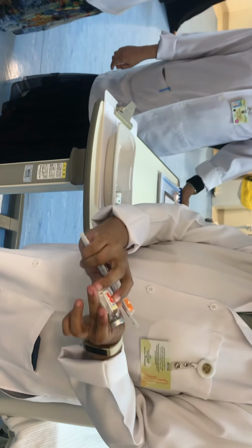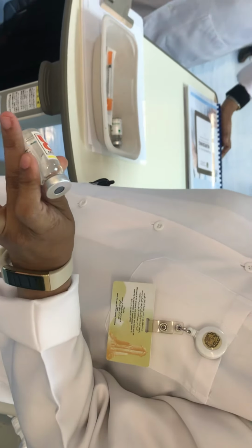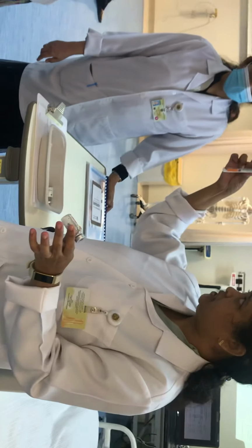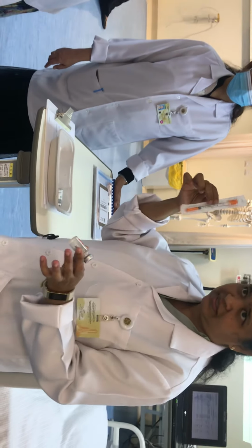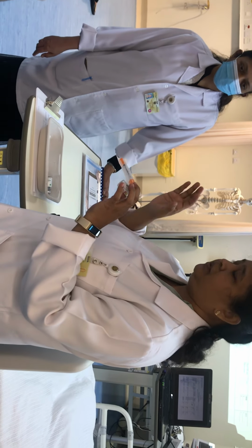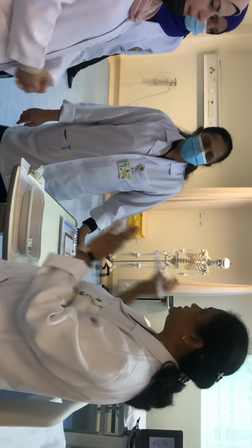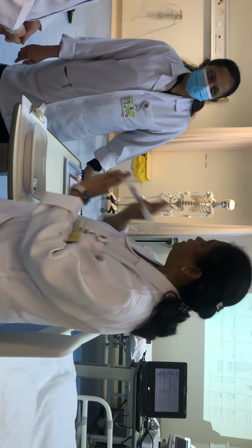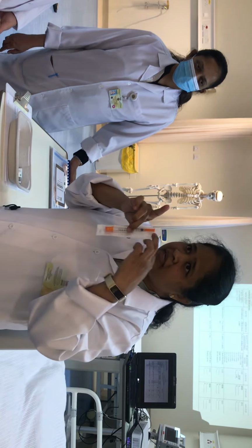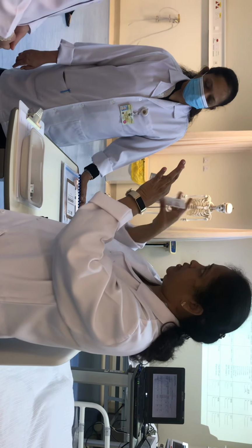See, this also is 100 units in 1 ml. Patients are taking it at home, so the companies have made it easier. 100 divisions are there for 1 ml. This is a 1 ml syringe. So if the doctor is saying 16 units, you just take the 16 mark. That's all. No calculation at all for any insulin. It is very easy. Whatever number is ordered, you take that many divisions, because these both are made for each other. Patients are doing it at home.